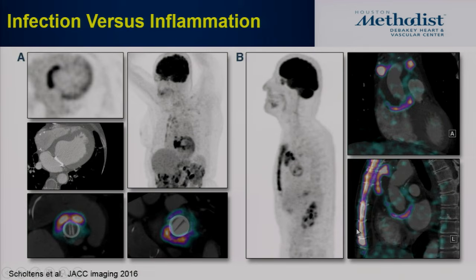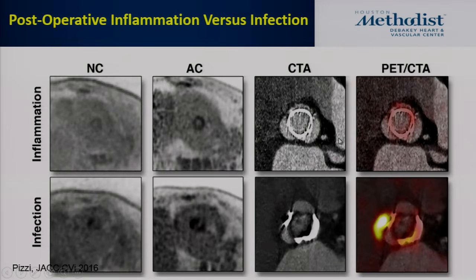And in this patient, they had used a special glue material. This glue material that they used in the sternum lights up with FDG for some reason. It causes a lot of local inflammation, and it lights up in there. So these are very important aspects for us to know when we are doing these.